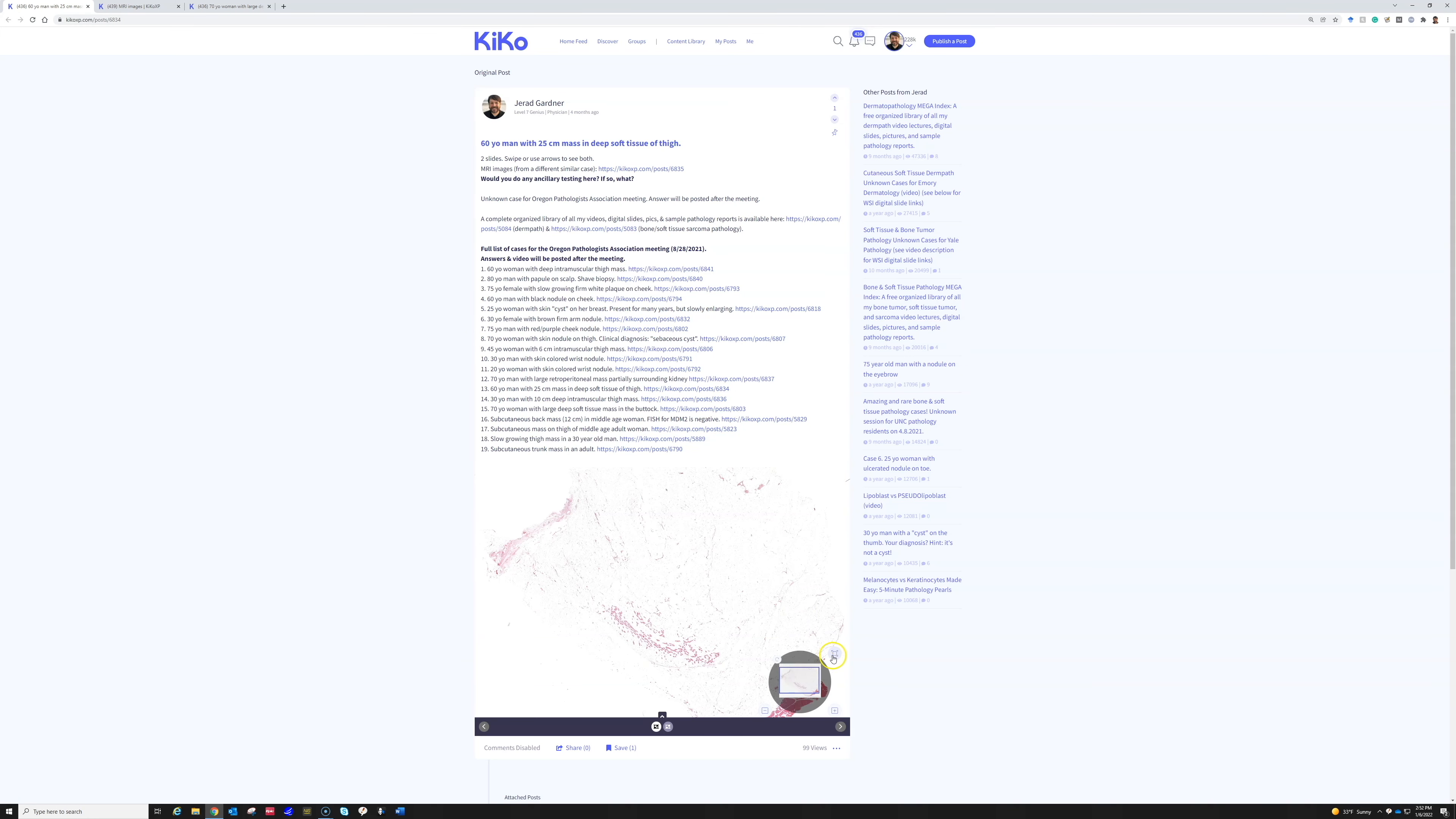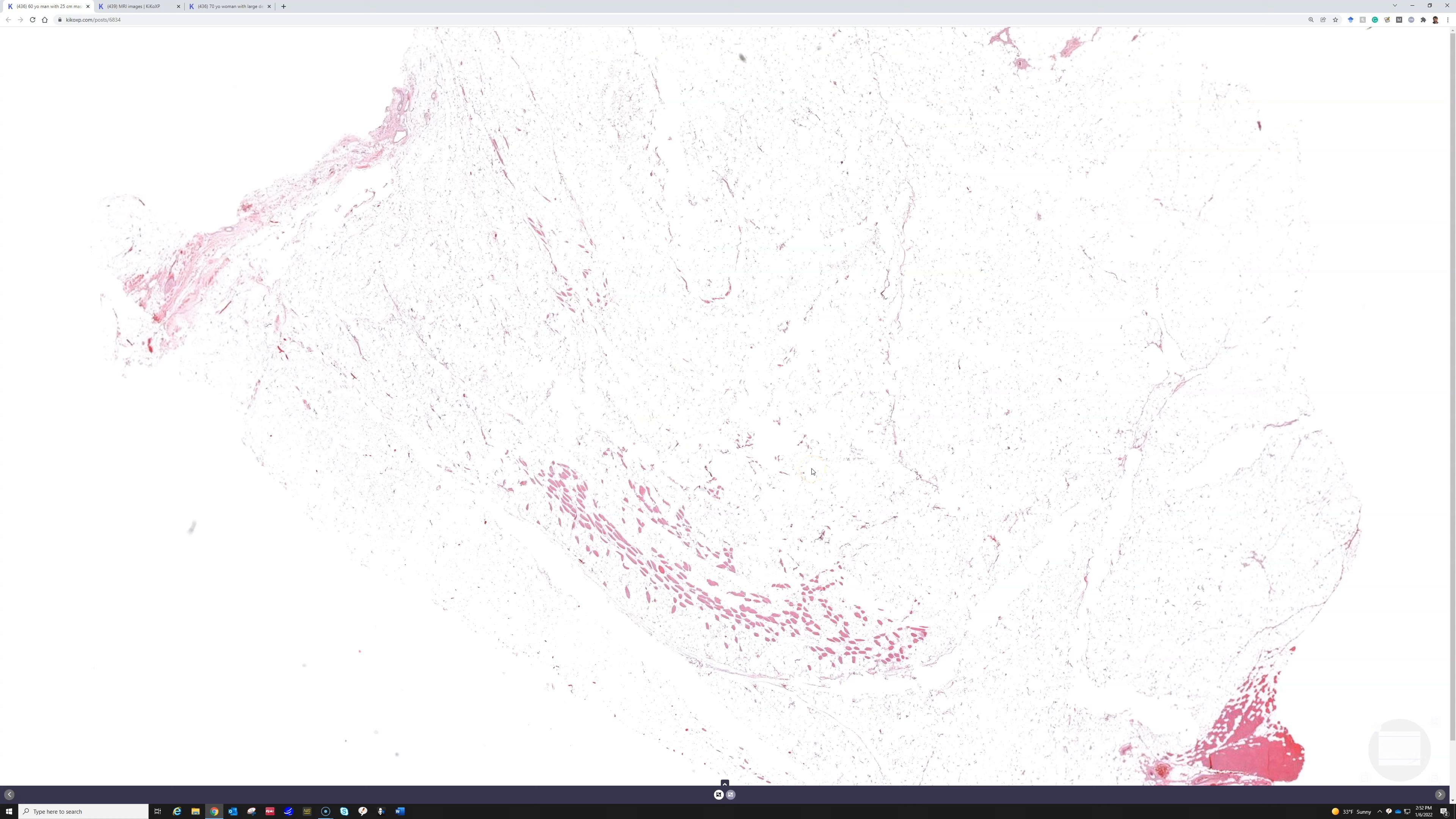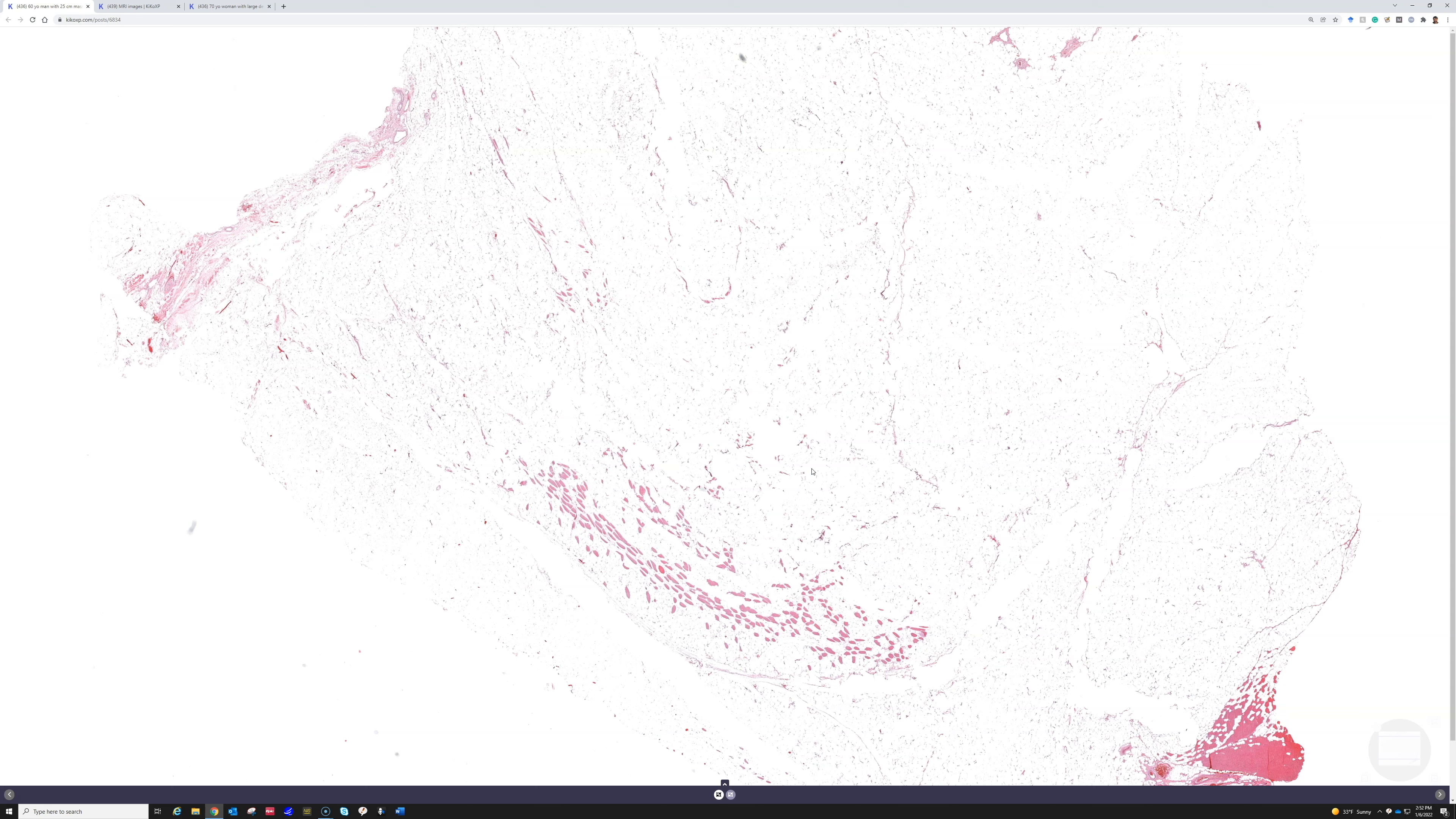Very good. So right away that scan to me is like classic for atypical lipomatous tumor, which is the same thing as well-differentiated liposarcoma. We just give it a different name depending on where it occurs. If it's in the retroperitoneum or less commonly you can see the mediastinum, or another site that is pretty common is paratesticular.